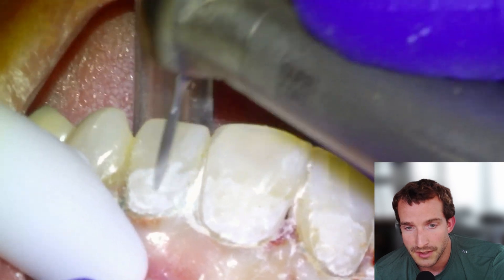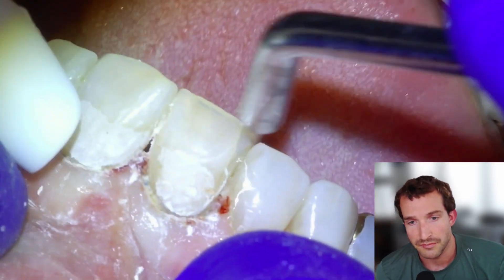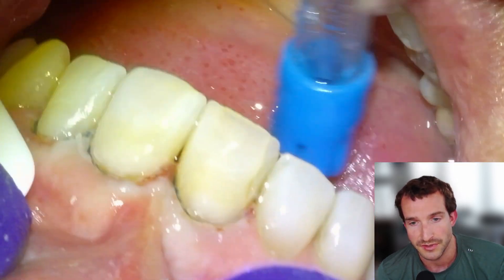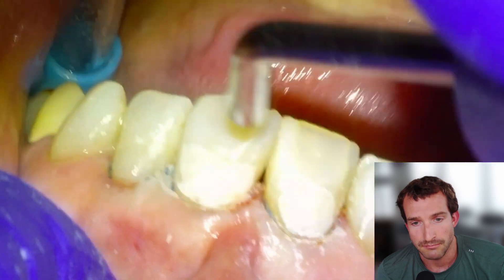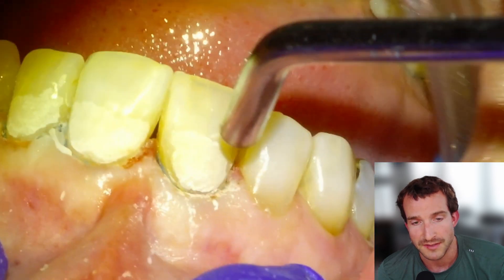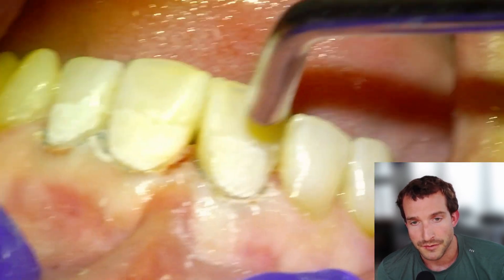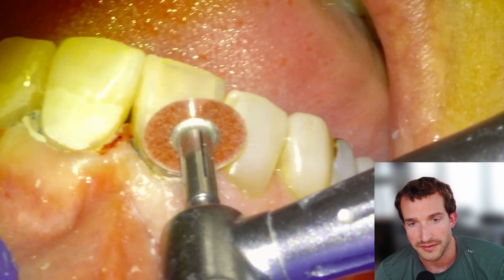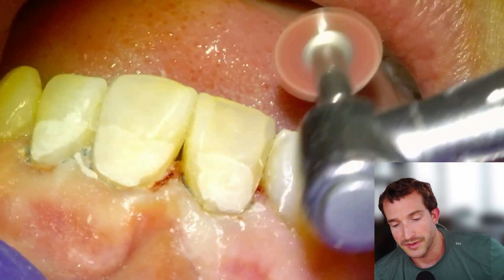There's actually a trick you can use in terms of shading — you can moisten the material to see what base shade it's going to look like. If you picked too white of a color, you can use Equia Coat because it has a little bit of yellow color character in it. Or if it looks bang on when moistened, you can just use an unfilled resin bonding agent to coat the material so that it feels smooth to the patient's tongue. In this case we used an unfilled resin bonding agent and ended up with a good result — the patient was happy.